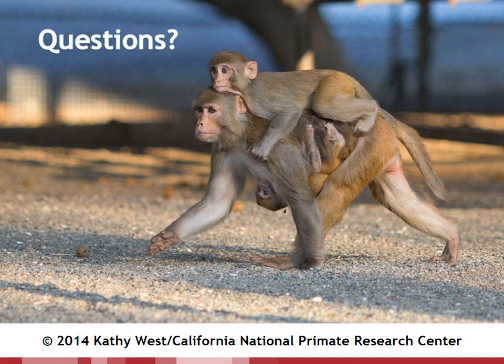New question here from Tanishka, who's asked, can we differentiate between receptor subtypes using EEG? I don't think you can, just because of the distribution of these receptors in the brain. They're really largely distributed throughout the brain. So I think it would be very hard to get to a specific region where you only have a subtype of receptors. What you can do, and that's something that we've been doing in the lab, is using selective GABA-A receptor modulators to understand the pharmacology. So you can get an alpha-1 selective GABA-A modulator compared to an alpha-3 selective or an alpha-5 selective. And then using that pharmacological selectivity, you can get to the role of each GABA-A receptor subtype on the EEG effect of drugs. And that's also something that we're actually starting to do now in the laboratory as well.